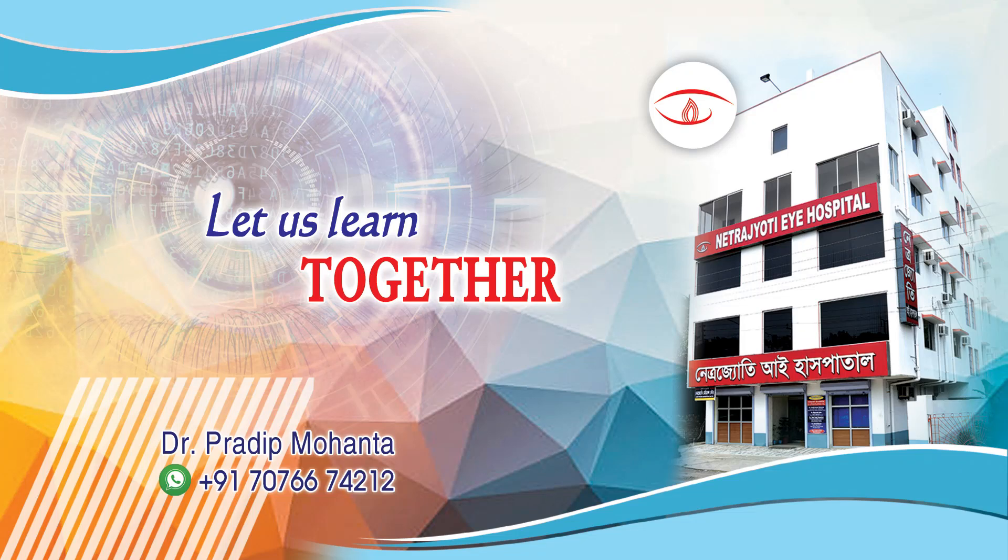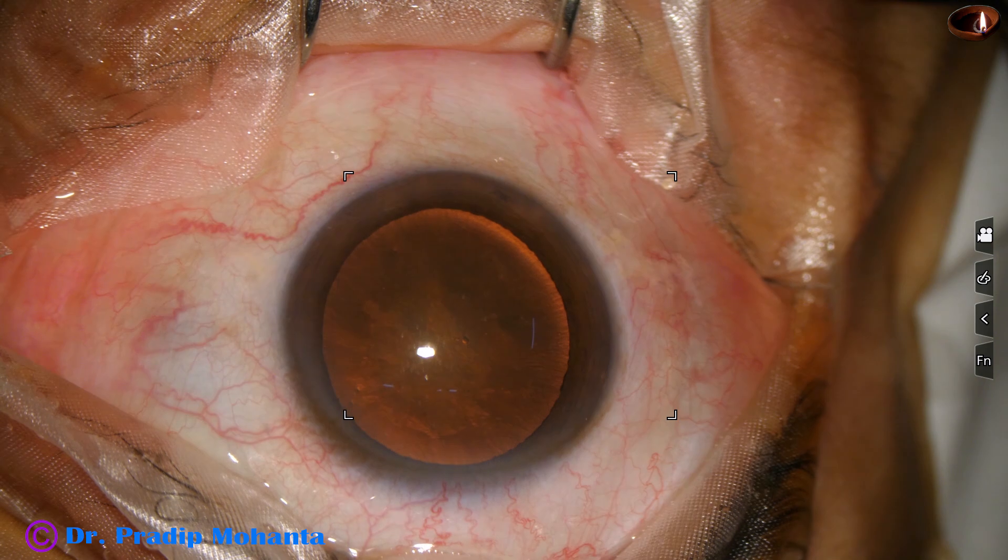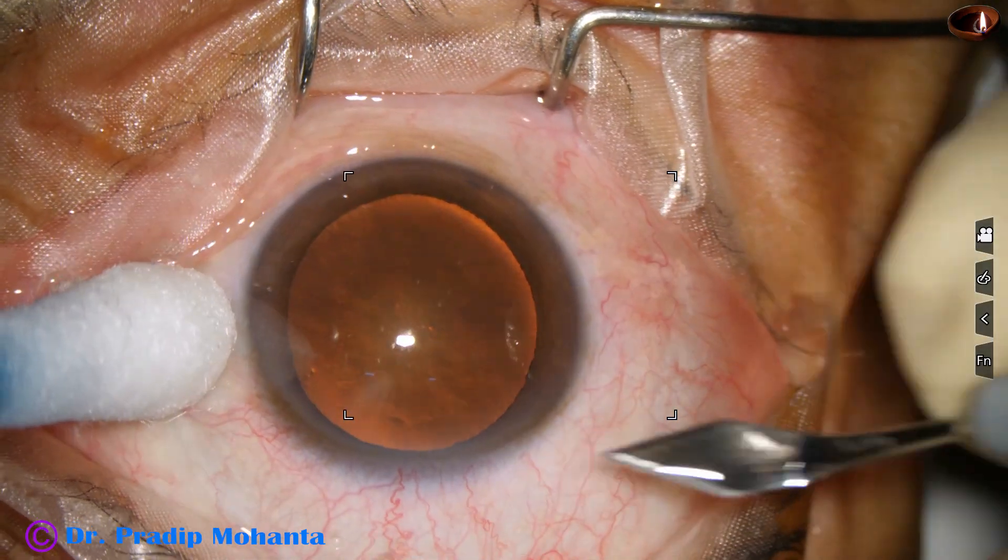Friends, welcome to my workplace at Ranaghar, West Bengal, India. This is a gummy soft cataract. The patient has been having diabetes for 16 years. Let us observe this surgery.